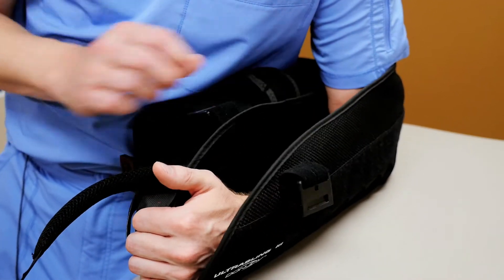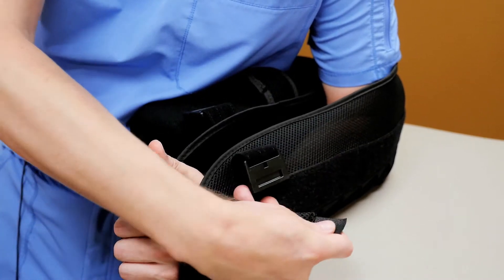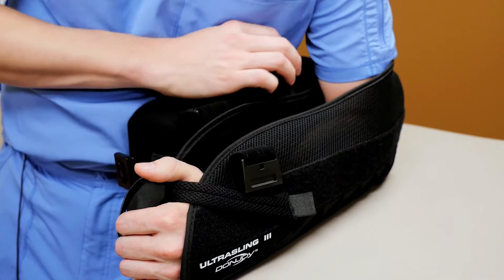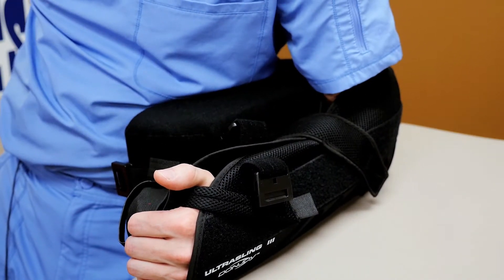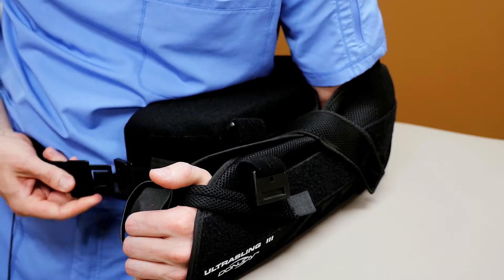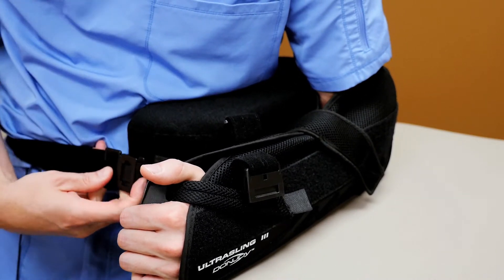Simply, it's just the opposite process — fasten the strap through the hand, then the strap around your waist, and then the strap that comes around your shoulder.